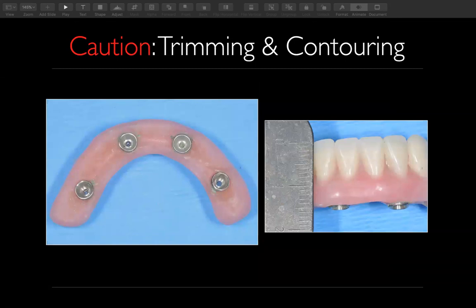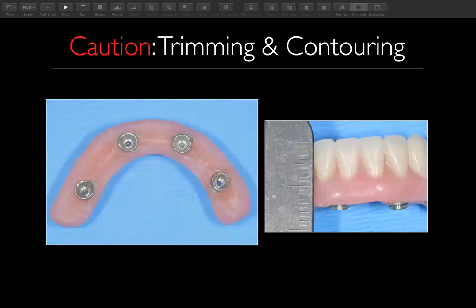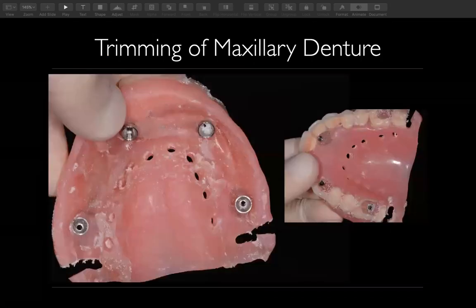Sometimes doctors might say, hey, cantilever one tooth. And I'll say, well, typically we don't, but if you want, I understand, fine. As long as you're aware that if that does fracture, and it probably will, the patient will break that off and cause an issue. We want to make sure we're at about that 15 millimeter thickness. But again, you're at the mercy of the bone reduction that was done. So sometimes you may have it, sometimes you may have a little more, sometimes you may have less.